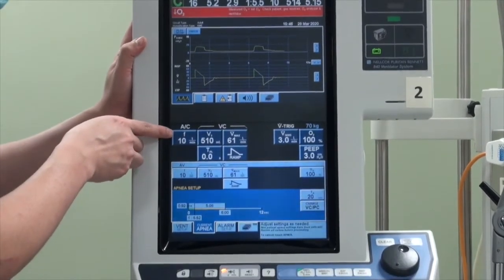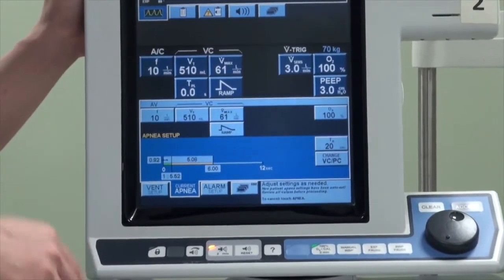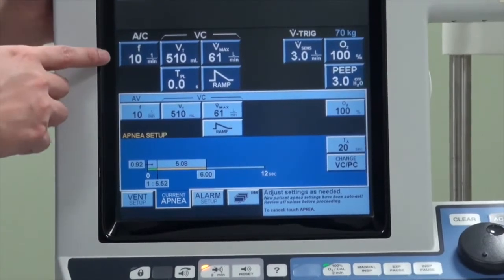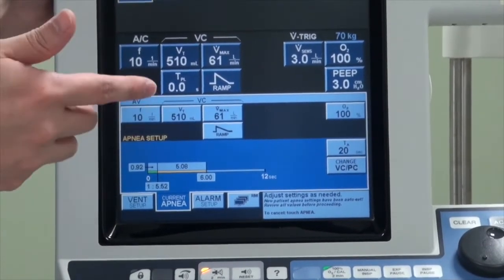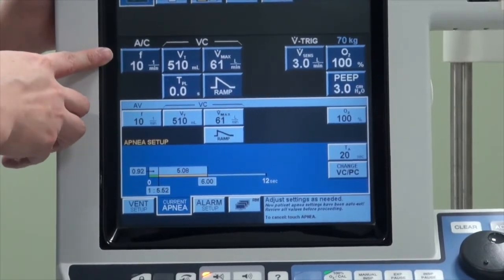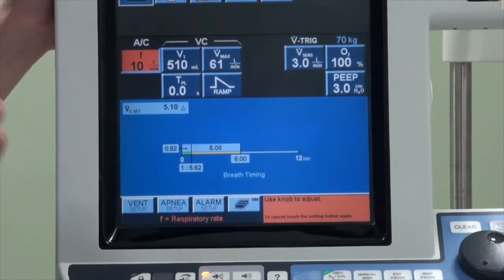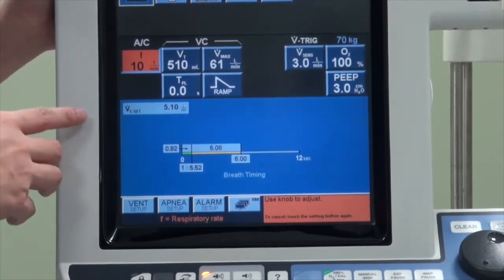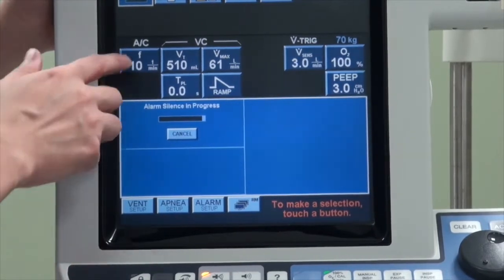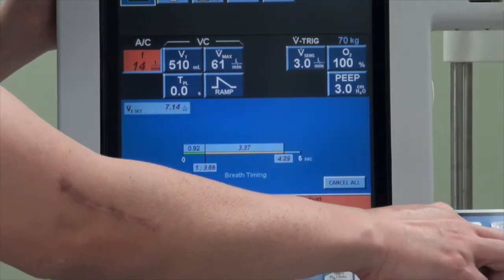The first button is F, or frequency — the respiratory rate you set for the patient. If the patient has no respiratory drive at all, the machine will cycle every few seconds based on what you set. For example, if you set at 10, every six seconds the machine will deliver that breath. To select the button, press it and it will become highlighted, then turn the dial to change the parameter.